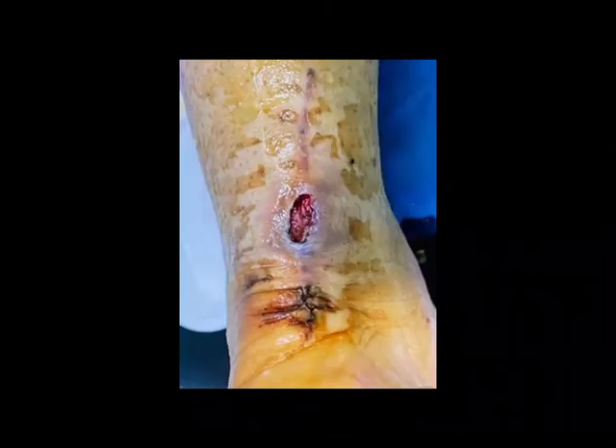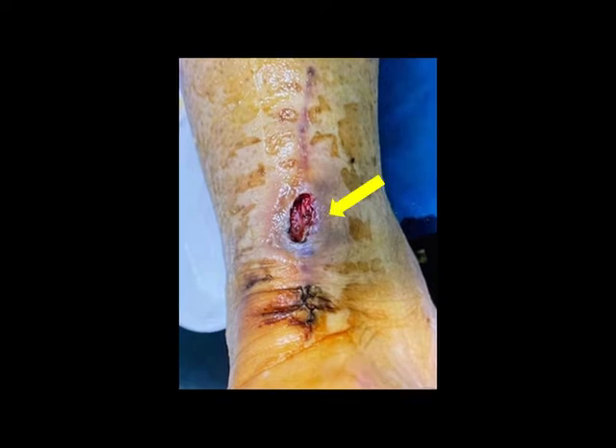Patients with delayed wound healing in the Achilles tendon area already have a defect into which the surgical instrument can be inserted. The other port selected is generally located at the top of the other side of the original defect.